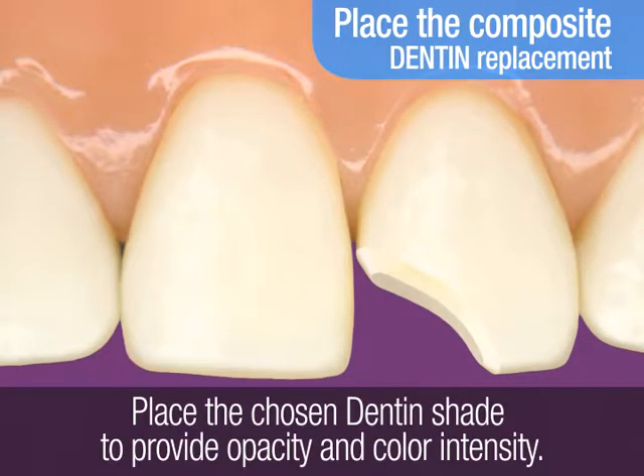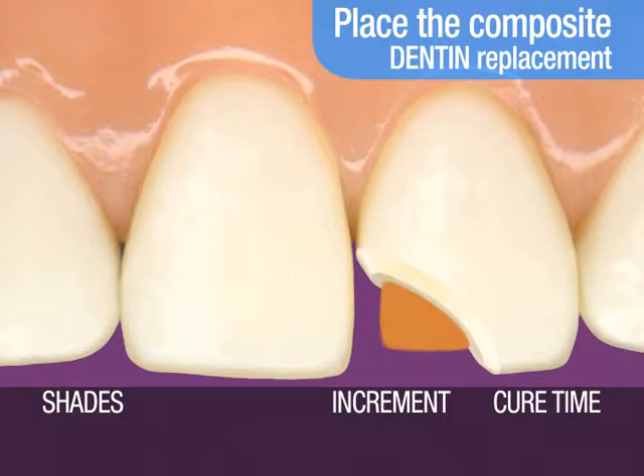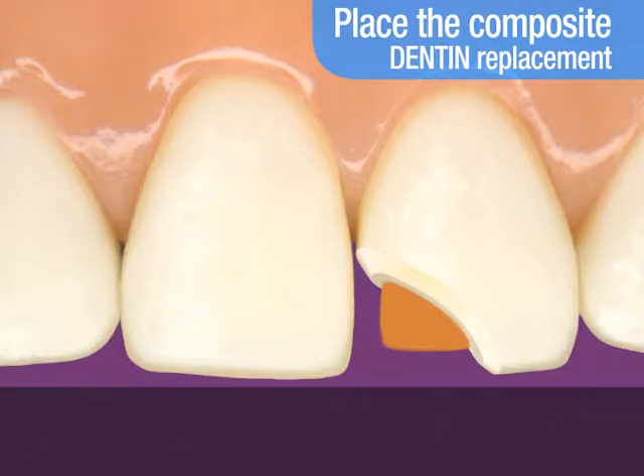you will first replace the dentin layer of the tooth with the selected dentin shade of composite. The dentin shade provides the restoration with opacity and color intensity. Light cure. The light cure time recommended for a 1.5 mm increment of dentin shade is 40 seconds.